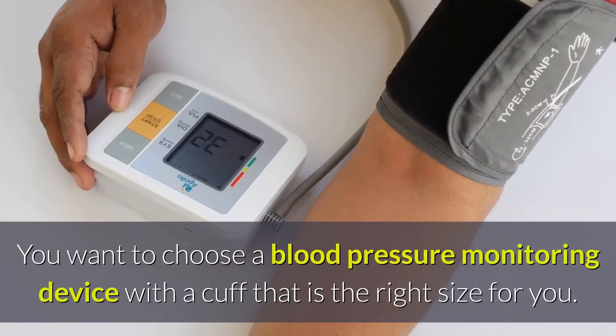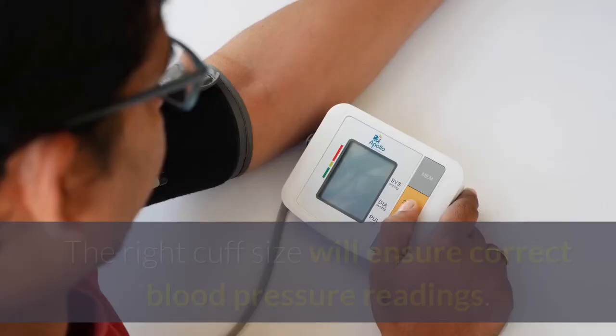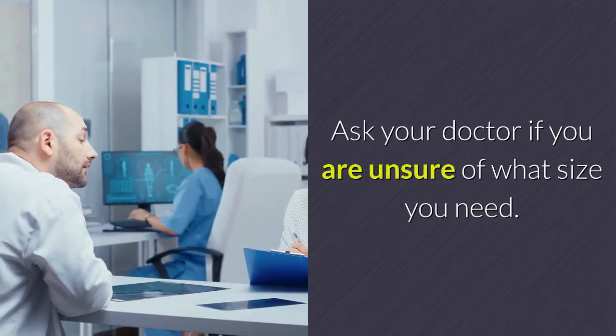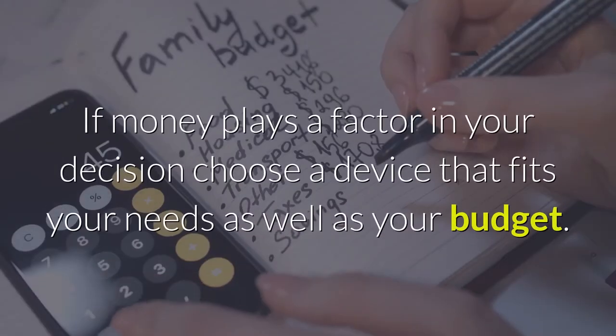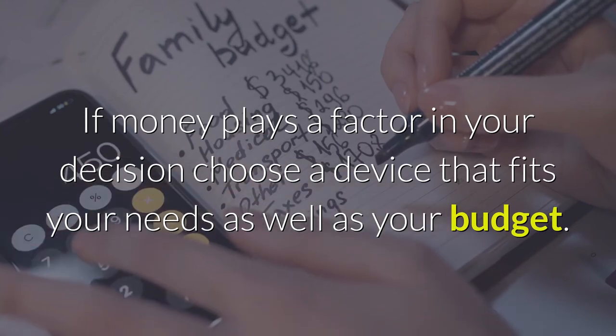You want to choose a blood pressure monitoring device with a cuff that is the right size for you. The right cuff size will ensure correct blood pressure readings. Ask your doctor if you are unsure of what size you need. Be sure you can easily read and operate the device. If money plays a factor in your decision, choose a device that fits your needs as well as your budget.